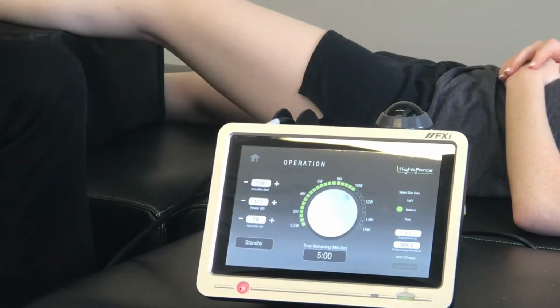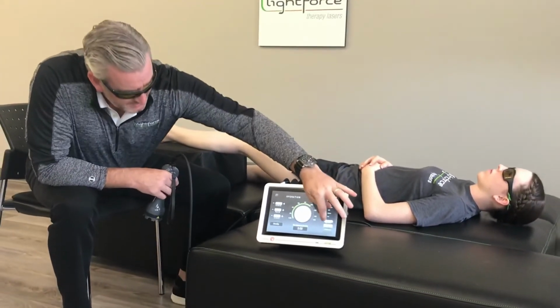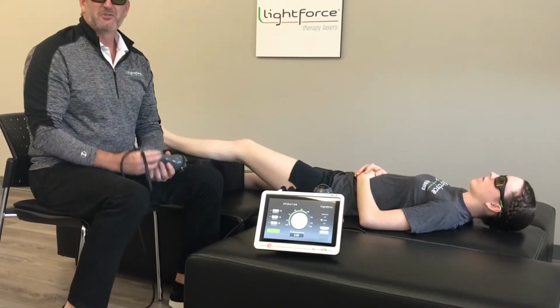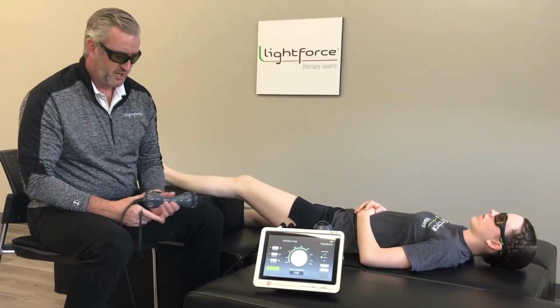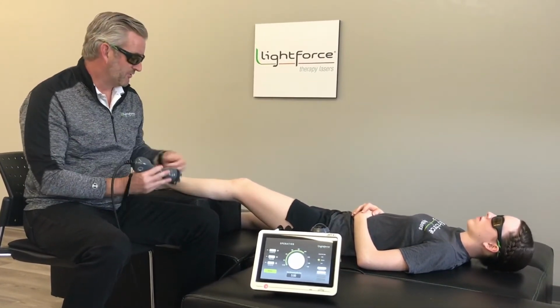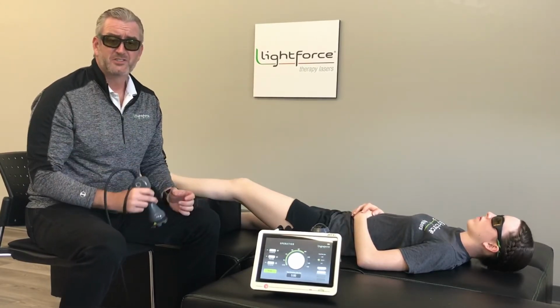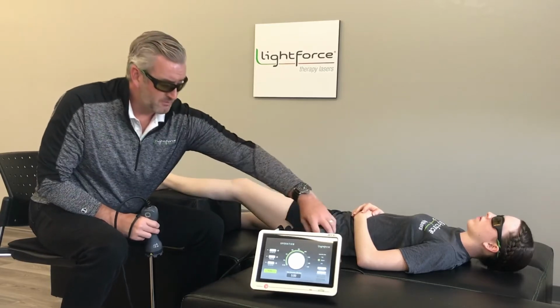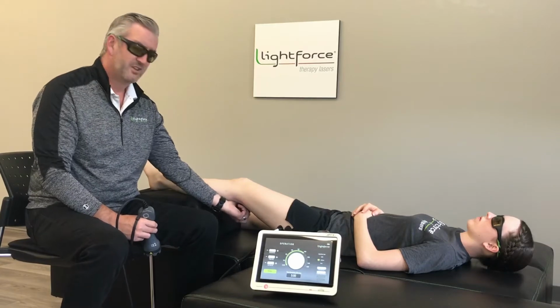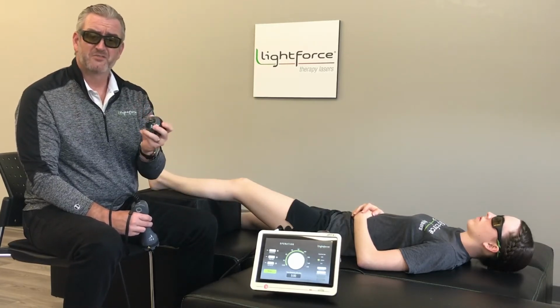So once you're ready, you'll put on your protective glasses, as the patient will have on the same. You're going to hit the standby button, which is then going to bring the laser up into a ready state. You're going to have a variety of heads that you can choose from. We recommend generally when you're going over the bony prominences around the knee, that the large cone is a good choice. Some people really like to use the massage ball, especially in the posterior aspect of the knee when treating those soft tissues, the bursa that lay back there. That sometimes can be beneficial when you're trying to do some soft tissue work as well.